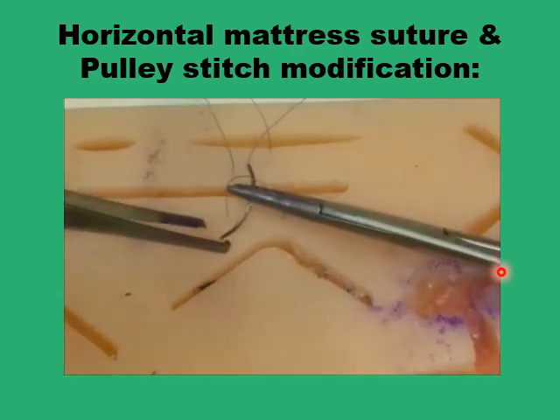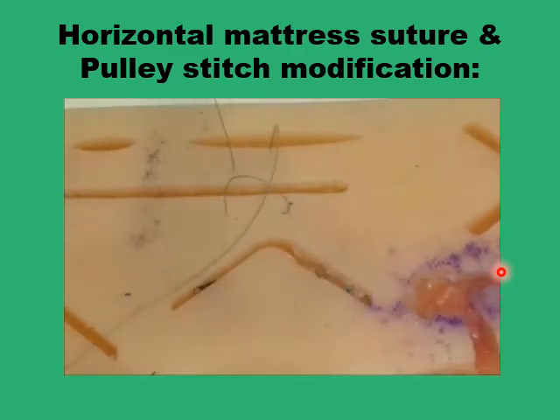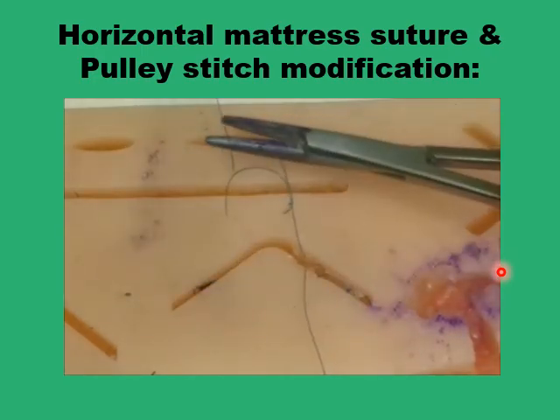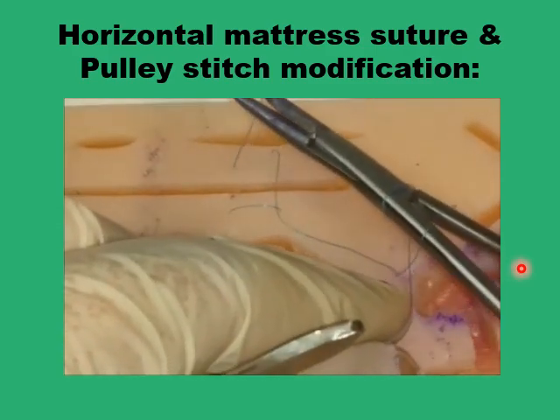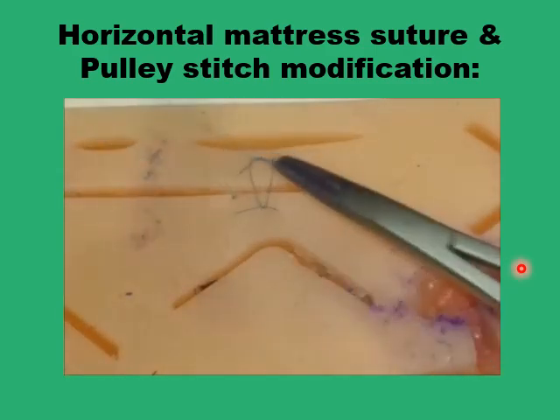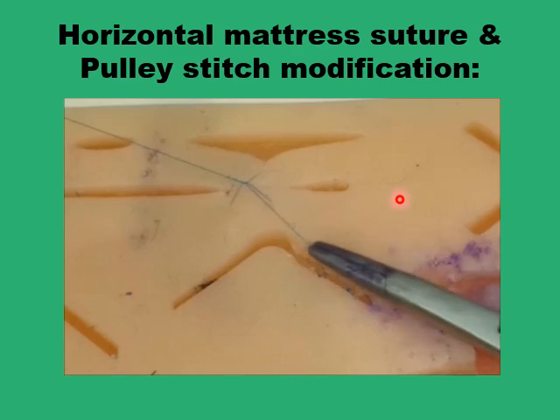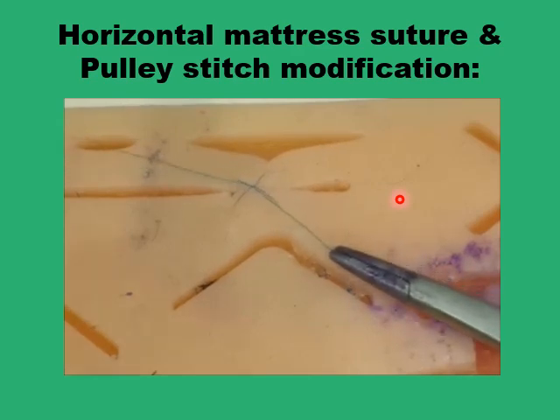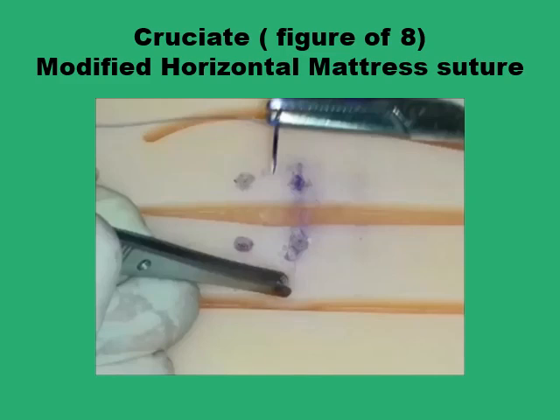By passing your needle through that loop, you create a pulley-like configuration which disperses wound tension in a better way. You'll notice that this configuration holds the wound in good approximation even without putting any tension on the suture ends — dropping the needle and the other end, you can still see good wound approximation.